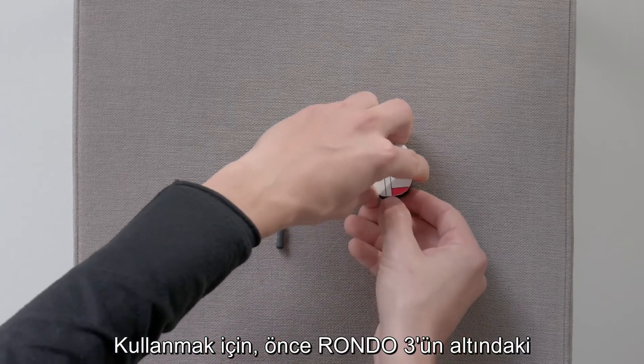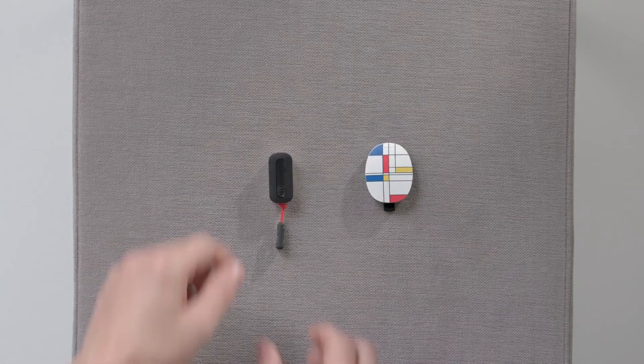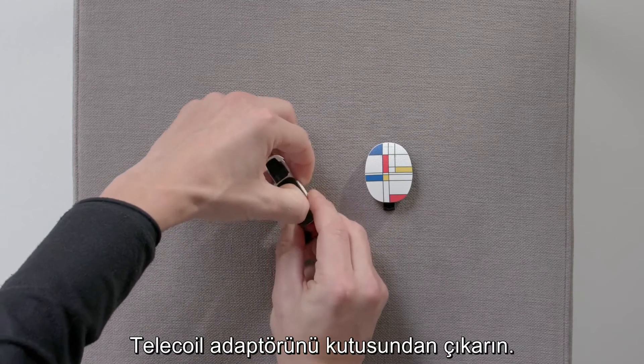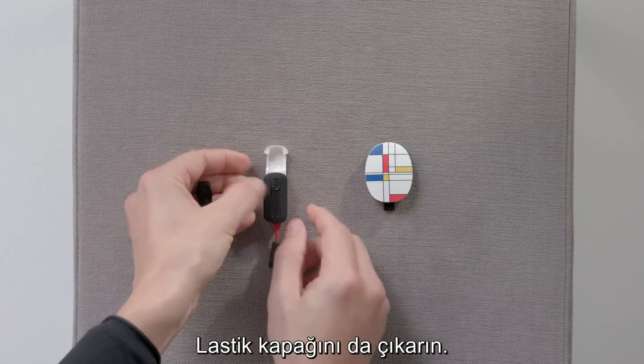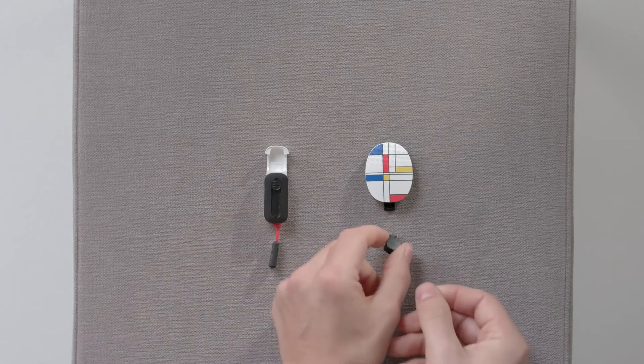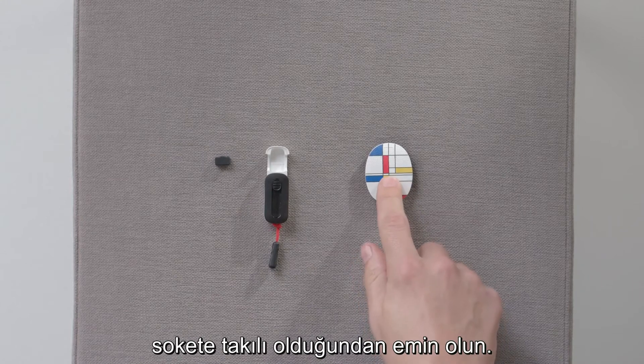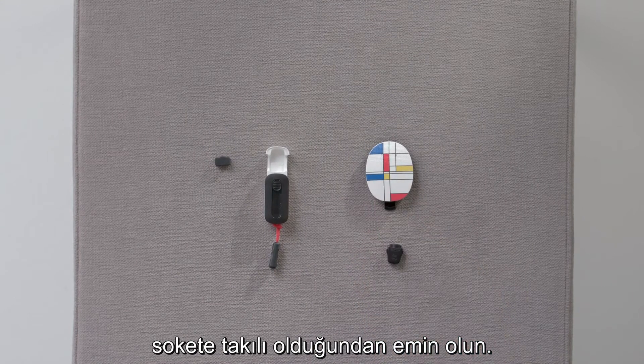To use it, first gently open the rubber socket cover at the bottom of RONDO3. Remove the telecoil adapter from the case and take off the rubber cover. Ensure that RONDO3 is turned on and plug the telecoil adapter into the socket.